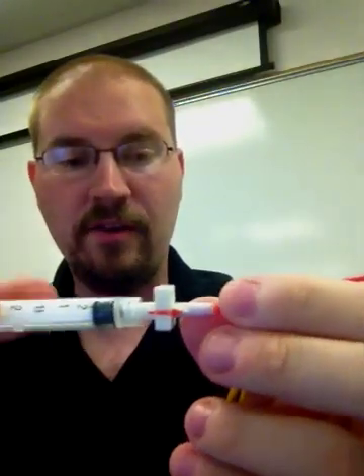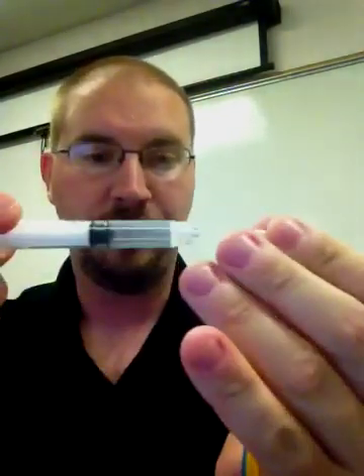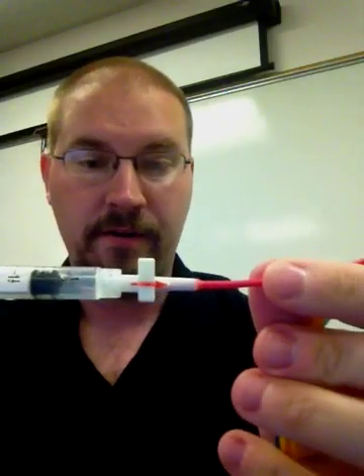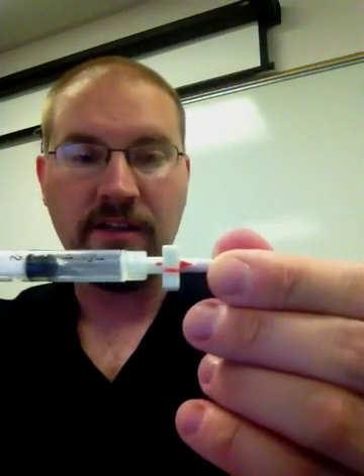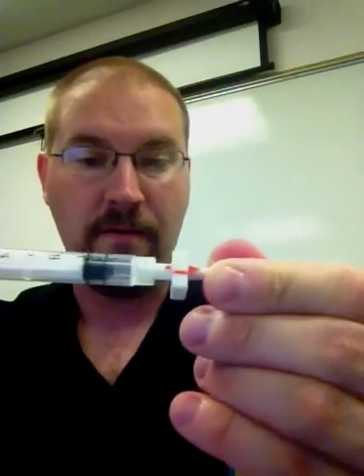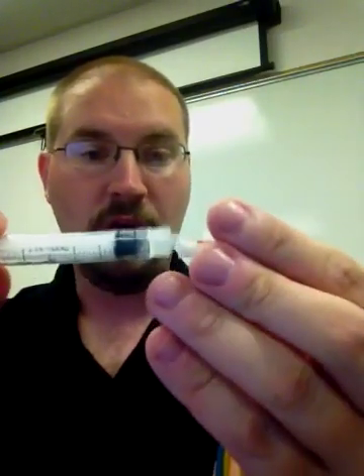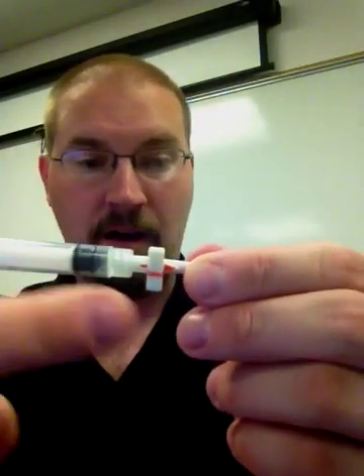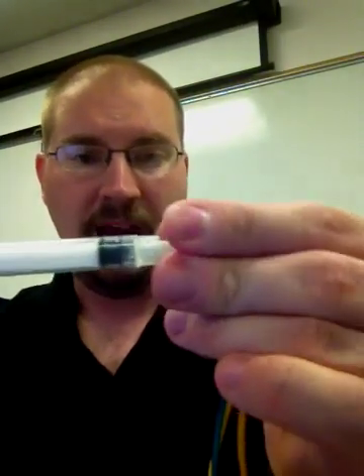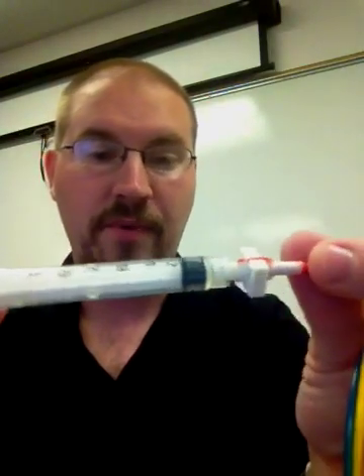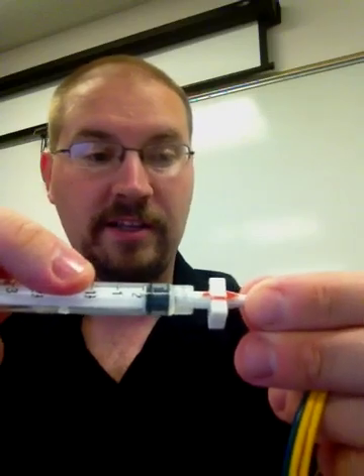This is a safety mechanism: when you see a straight line on the port, that means you are able to put air into it. For safety, go ahead and lock that port off — you can see the line is broken and you can no longer introduce air. When someone has a catheter in, make sure that port does not communicate so you don't inadvertently get air into it. Definitely make sure this syringe stays with the patient for safety. This port is simply for inflating the little balloon on the distal end of the catheter.